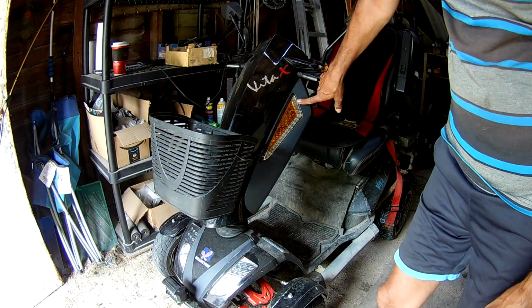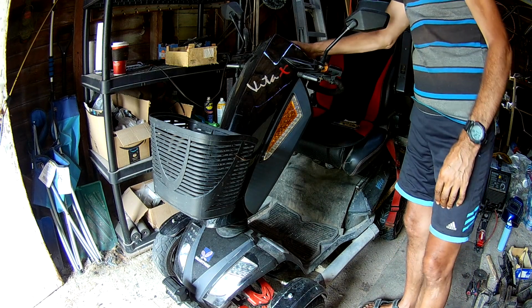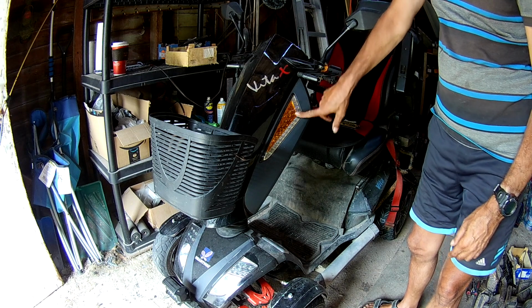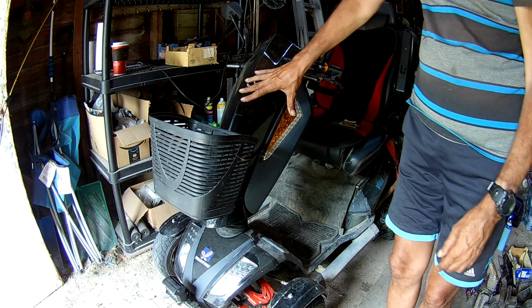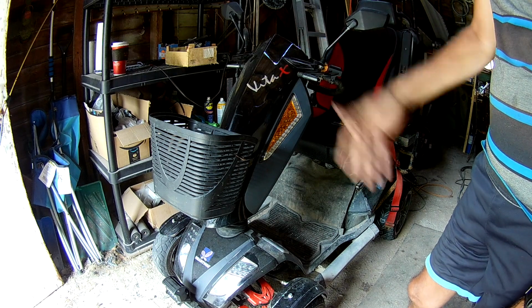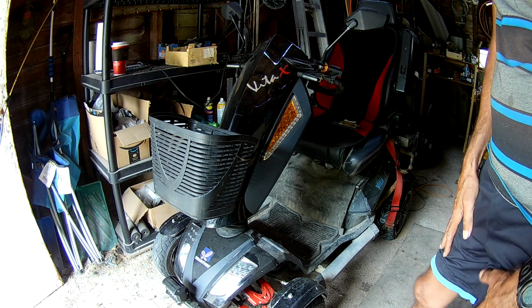The tiller lights are not coming on. If I put the four-ways on, they work. It's just the white ones that are not working, and they provide most of the light. So I knew something was wrong when I got home. That's when I discovered, oh, that's not good.